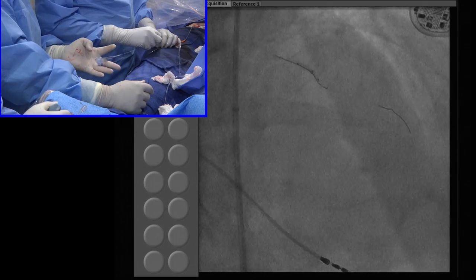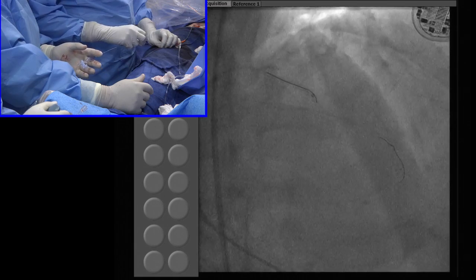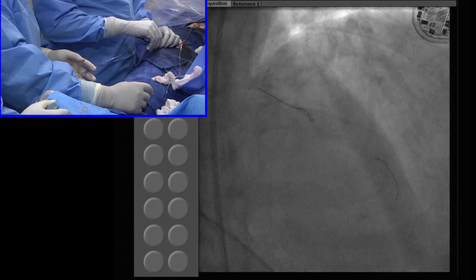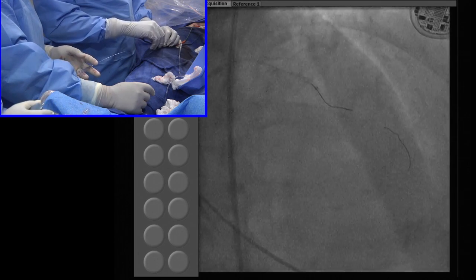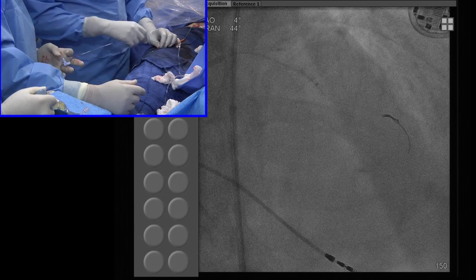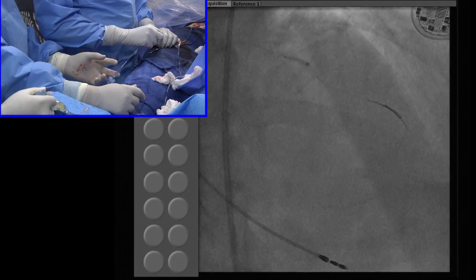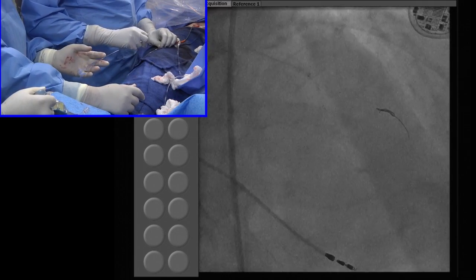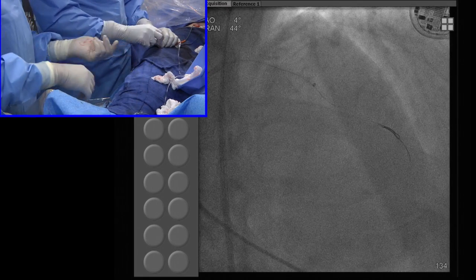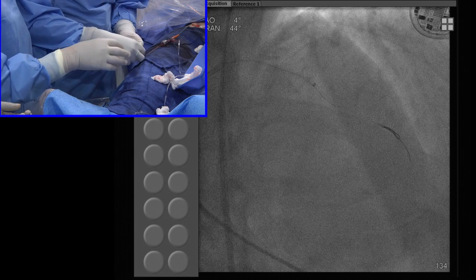Deep breath. That angle is a problem. Not to push too much, right? Okay. Breathe normally. Good. Did you change the stent or not yet? We should. It's too much you're doing. The other small vessel issue is that, see, the Fielder does not go at all. This was the 2.25, no? Yeah. Well, actually, now we have the 2.0.